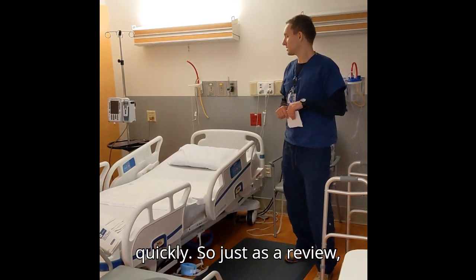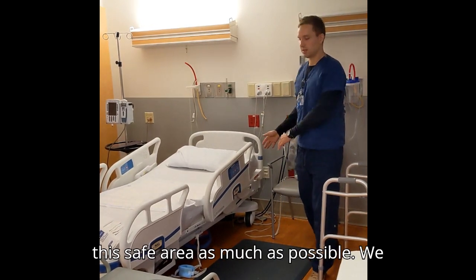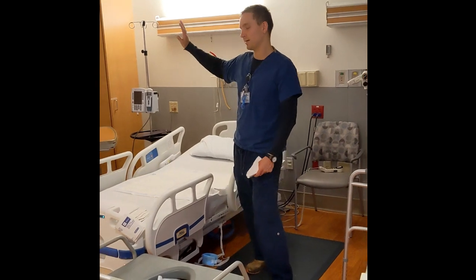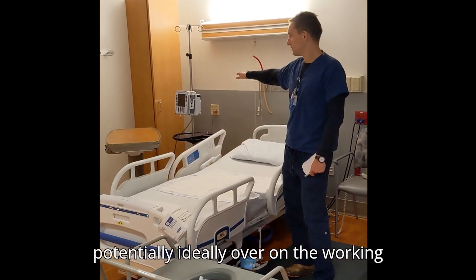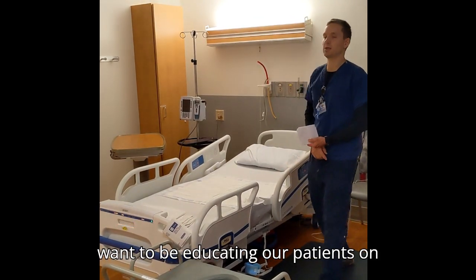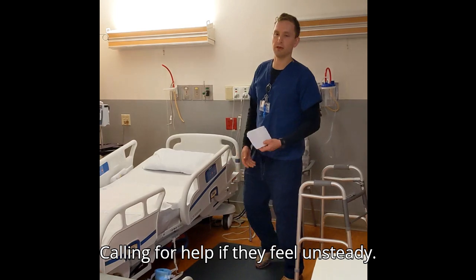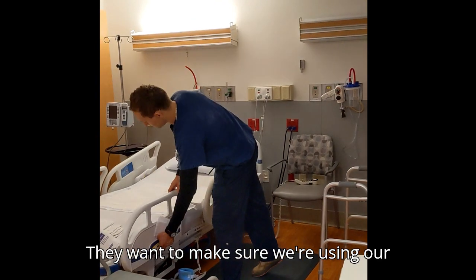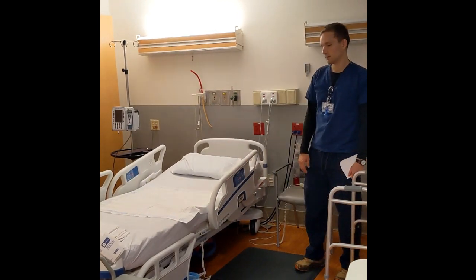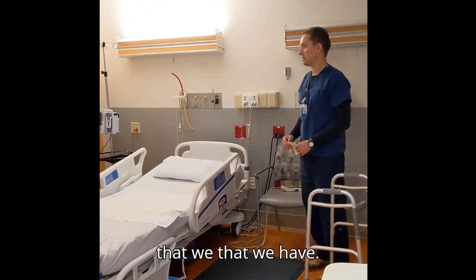So just as a review, it's important to keep in mind that we want patients using this safe area as much as possible. We want to keep it clear. We want to have all our equipment and any things that they could trip on potentially, ideally over on the working side of the bed. We want to be educating our patients on using their assistive devices, calling for help if they feel unsteady. We want to make sure we're using our side rails smartly, making use of the recliners and all the other equipment that we have.